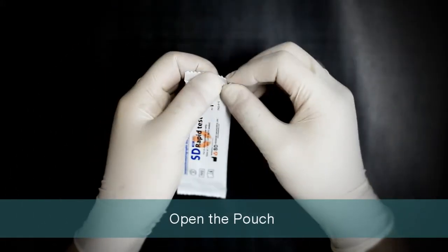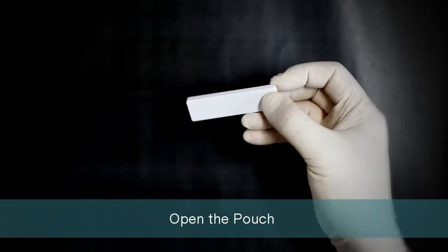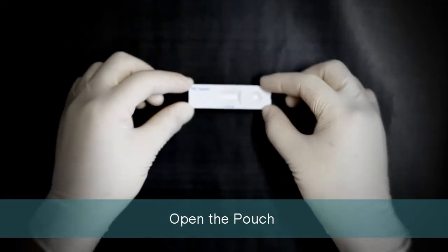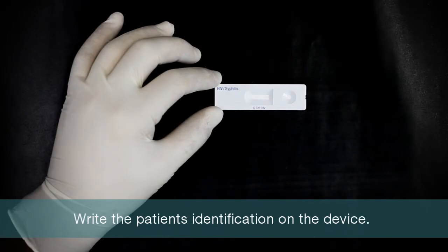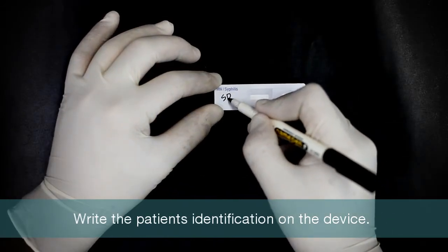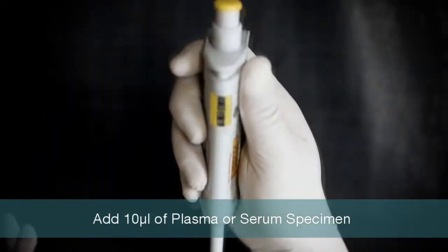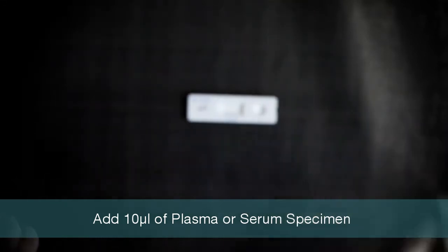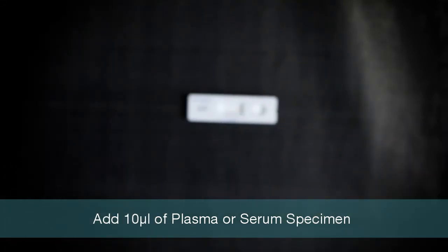Open the test pouch and set the test device. Write the patient's identification on the device. Using a micropipette, take 10 microliters of serum or plasma and put it into the sample well.